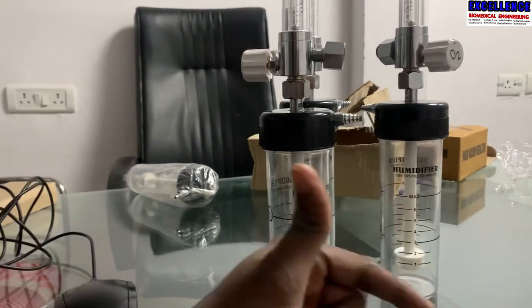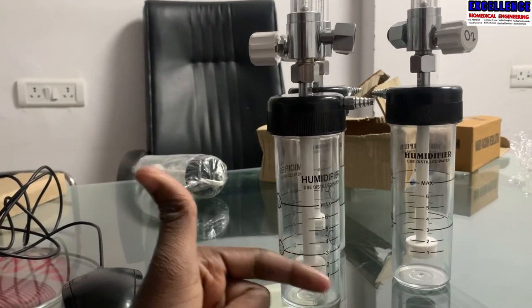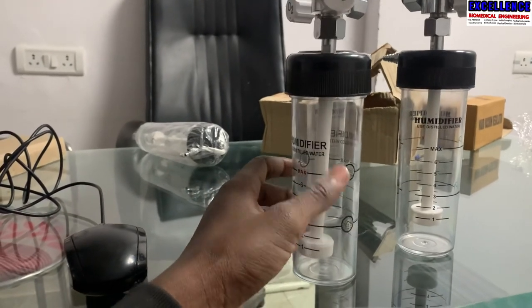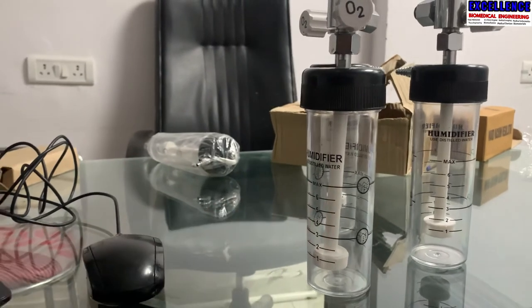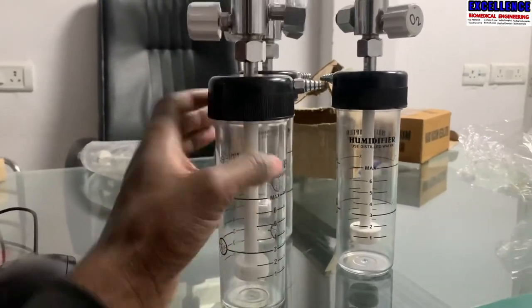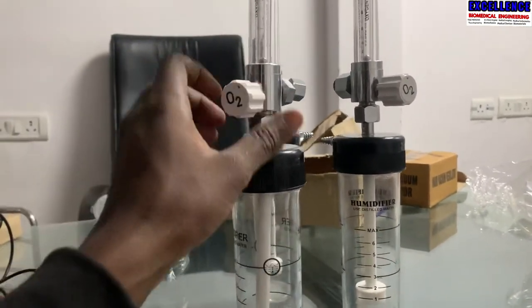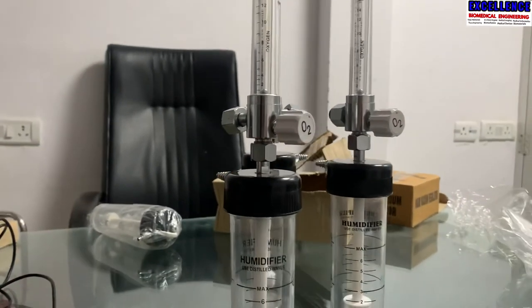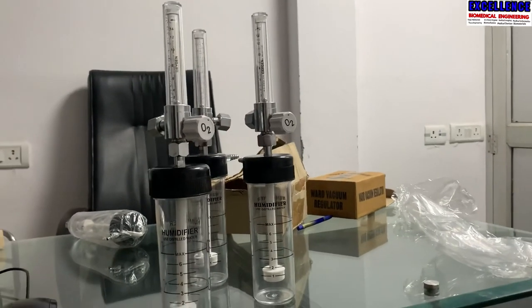The humidifier bottle is filled with water up to the required mark — as you can see here, there is a required mark for the level of the water. Thereby the oxygen gets humidified and is then supplied to the patient. Here we regulate the amount of oxygen we want to supply to the patient. This is how the oxygen humidifier bottle works.